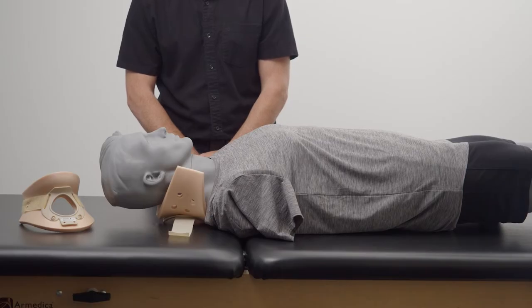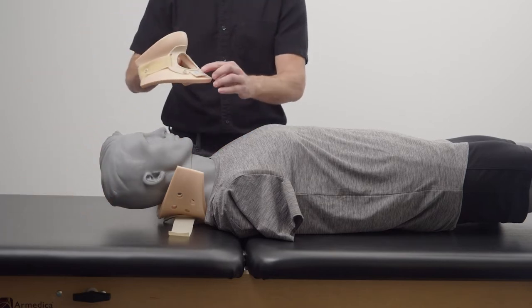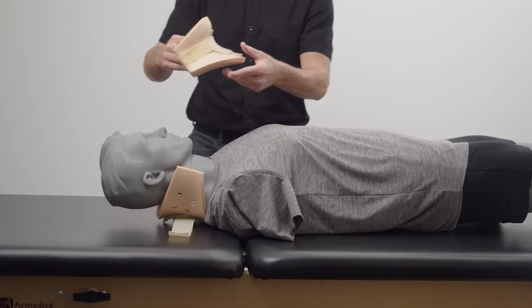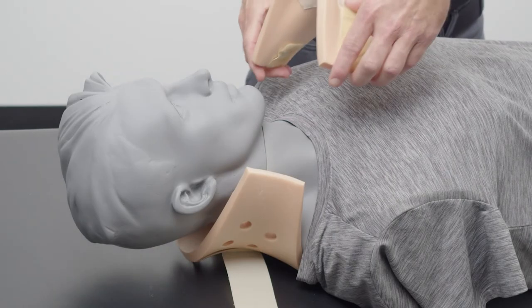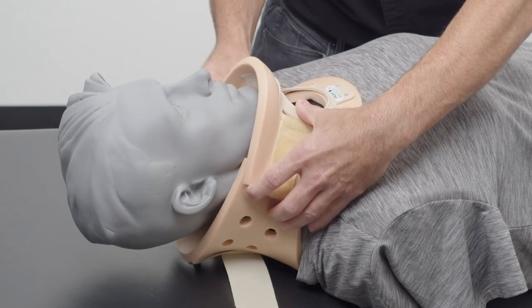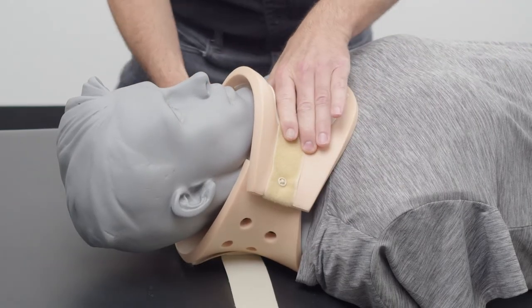Apply the front piece with the chin secured in the recess and center it to secure neutral alignment. Please see the up arrow on the anterior portion of the brace. Next, we are going to flare out the brace, sliding it so that the anterior portion slides in front of the back section panel.